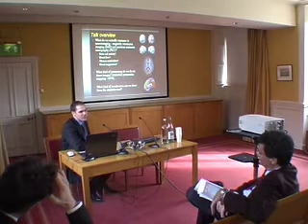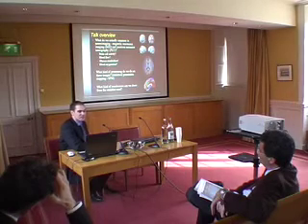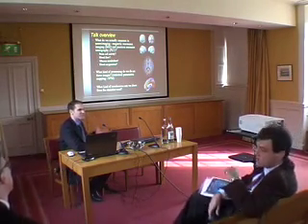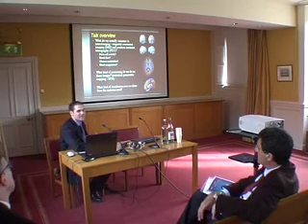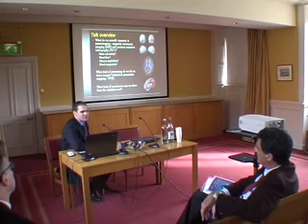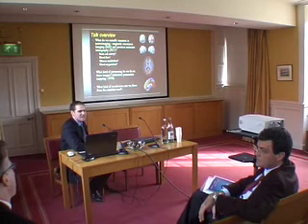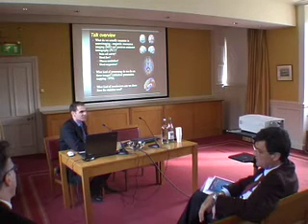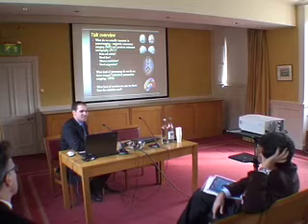And one thing I think it's important to understand right from the beginning is what we're actually measuring. There are a number of things that you could imagine that we might measure, and the first thing that you might naively think we could be measuring in brain imaging is brain cell activity. But unfortunately, we're not measuring brain cell activity. What we're trying to do is get a handle on what the brain cell activity would have been by measuring some kind of surrogate measure, so trying to understand other measures that probably correlate with that brain cell activity.